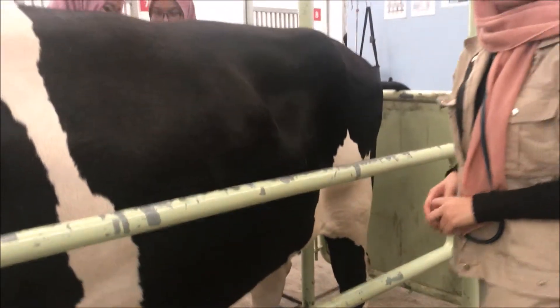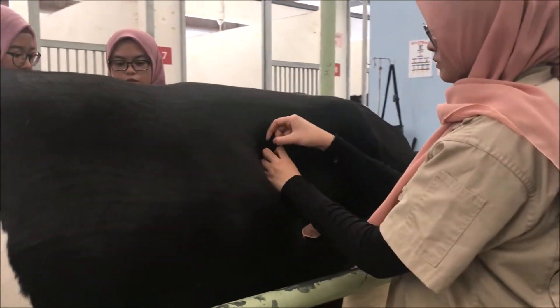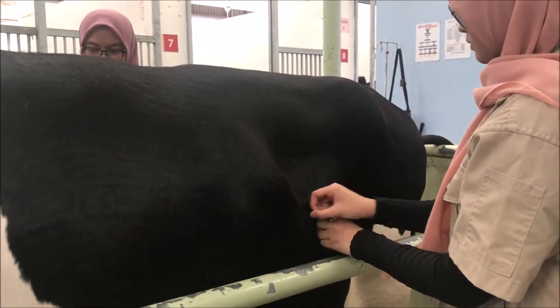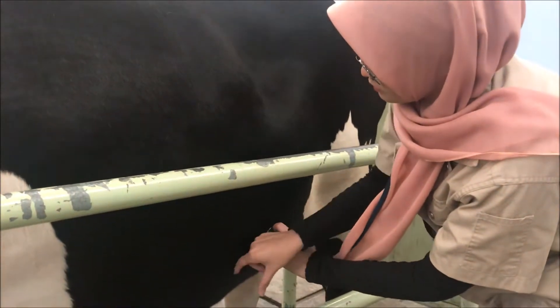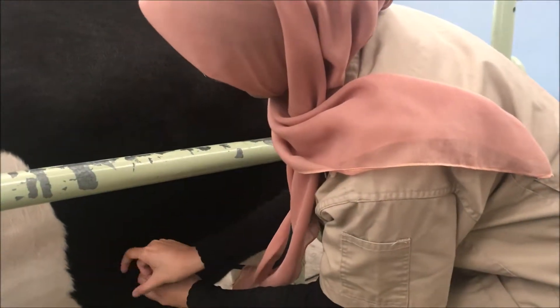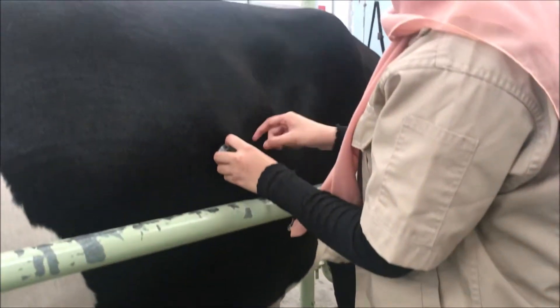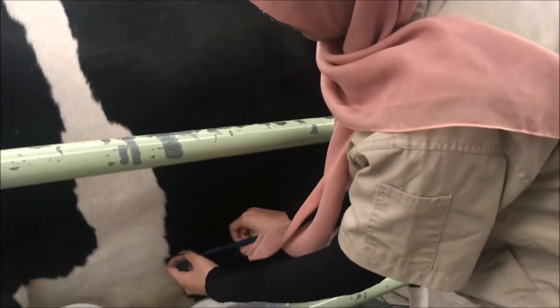First, a stethoscope is placed over the area that has been mentioned before to auscultate the cattle. The percussion technique by flicking around the stethoscope using fingers has to be done along with the auscultation technique. The sound radiated from the percussion technique is recorded.